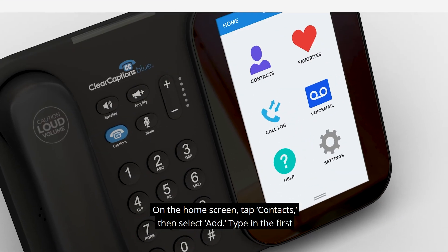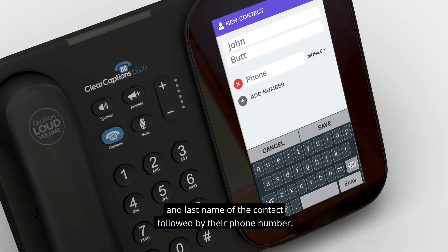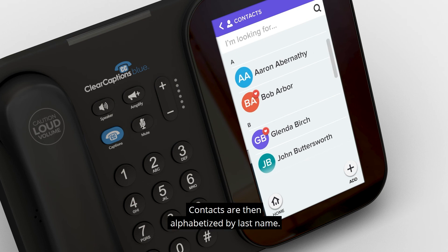On the home screen, tap Contacts, then select Add. Type in the first and last name of the contact, followed by their phone number. Contacts are then alphabetized by last name.